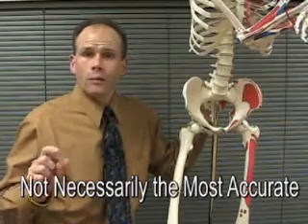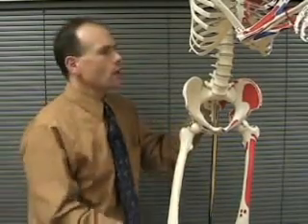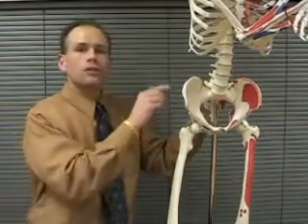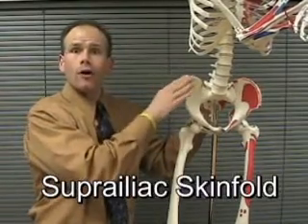Although if you do take the measurement in both the vertical and the horizontal direction, I tend to get almost identical measurements every time. Again, no research on that. Still follow the equation that you're using, follow their guidelines. So we have the calf, we have the thigh, we have the abdominal, and our other mid-body measurement is the suprailiac, above the iliac crest, suprailiac.